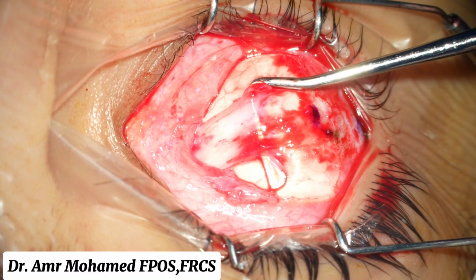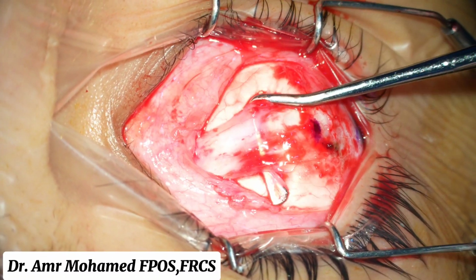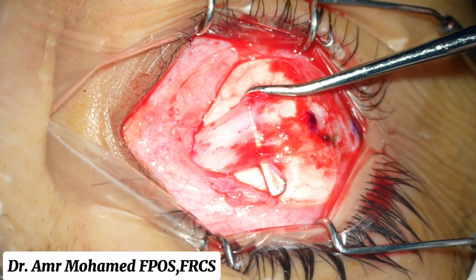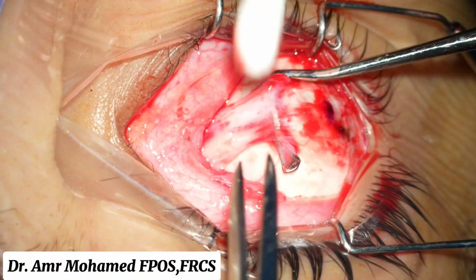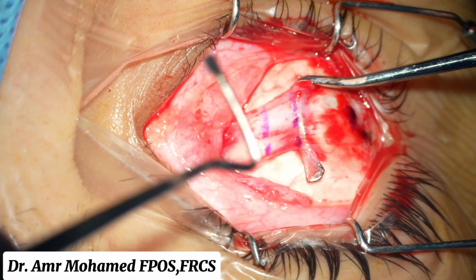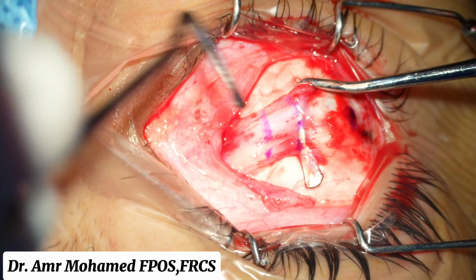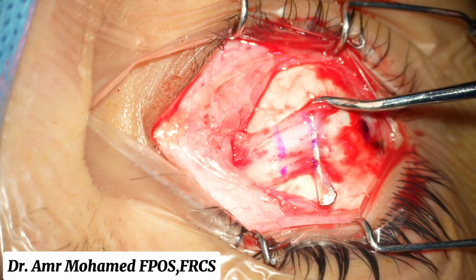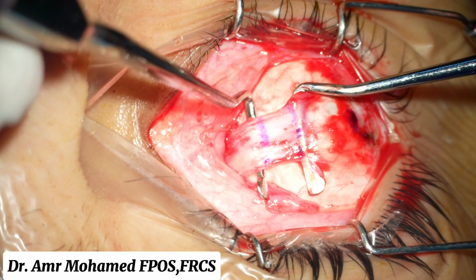After cleaning the muscle, you can figure out that there is a part that is a stretched scar or pseudotendon, and you can figure this out because you can see the hook behind the muscle. It's like translucent tissue, not like the proper muscular tissue.